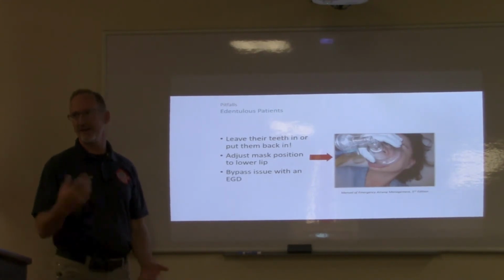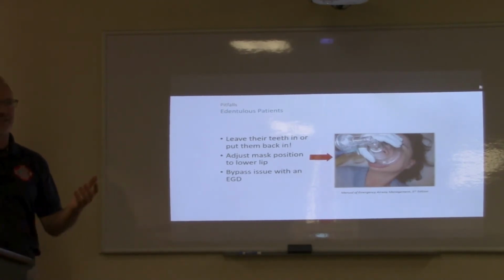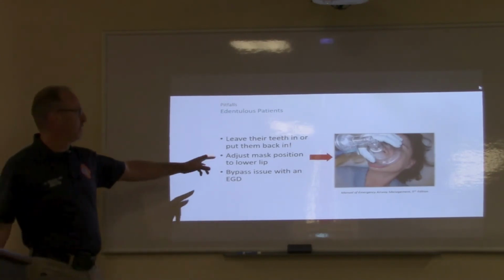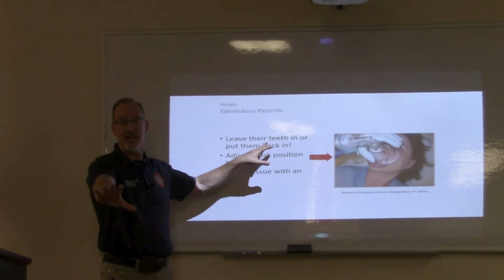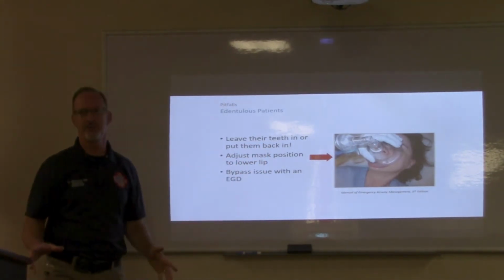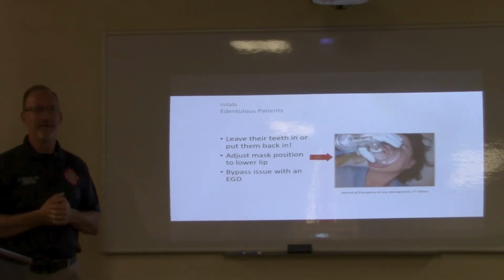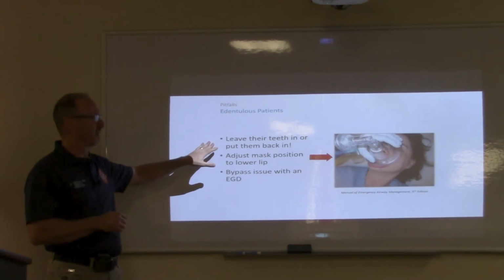Usually the first time you take the teeth out, it goes into somebody's glove and it just disappears off to the side, probably gets thrown out, but there's a disadvantage there. I don't think we do that too often, put them back in, but I sure tell people all the time, no, don't take those teeth out right now. I know you're all excited about your intubation. It's usually some very excited first year resident who's all set for the intubation. Before you intubate, we've got to keep the patient alive.